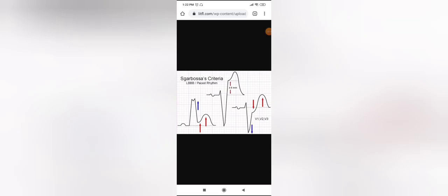In the first image, you can see concordant ST elevation — the QRS complex in leads I, AVL, V5, or V6 shows a notched upright R wave with concordant ST elevation marked by the red arrows. In the next figure, there is discordant ST elevation more than five millimeters, which is given two points. There is also concordant ST depression visible in leads V1, V2, and V3, which is given three points.